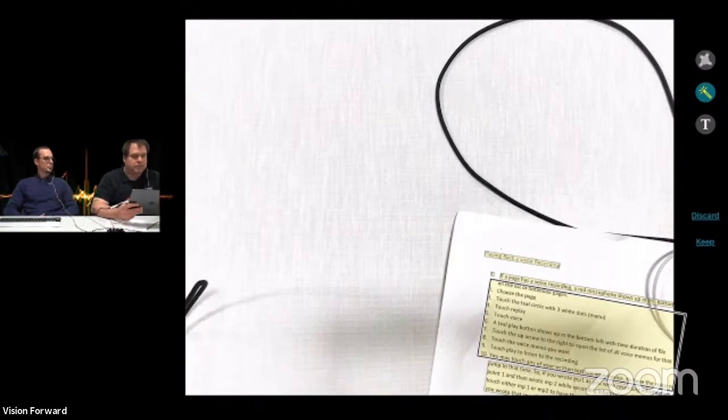There are some other features in VoiceStream Scanner as well, from auto capture mode. I have that turned off, but you can turn on auto capture mode, so it'll take the picture as soon as it sees all edges. There's also a batch mode, so you can do more than one page at a time as well. Love VoiceStream Scanner, great app, super accurate, very fast. All done on the device itself, so no internet is needed. It's not sending any of the information out to the cloud for OCR to be processed, so everything is staying private on your device.